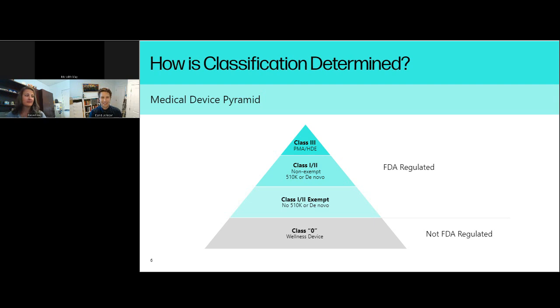That makes a lot of sense. And when you spoke at AMUG, because I think that's when I was first introduced to you, you also mentioned in the lot release, there's also the aspect of recyclability in powder and how does that shift things. And I think you mentioned there's not a great solution. So companies are trying to figure out how to safely ensure that any mixed batches or going from lot to lot is safe. Do you see any recommendations when it comes to testing, if there is a powder-based system that does mix versus one that might do just a direct material?